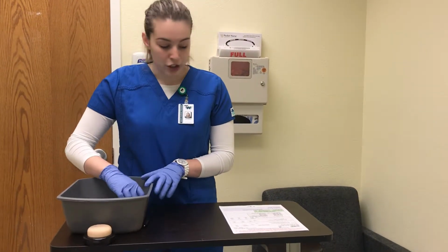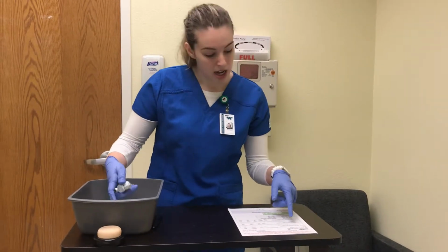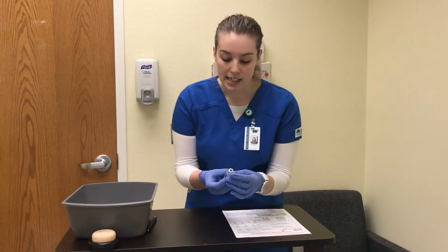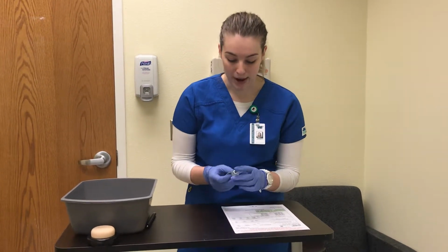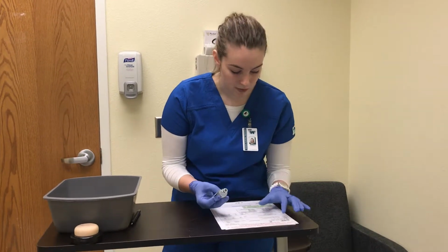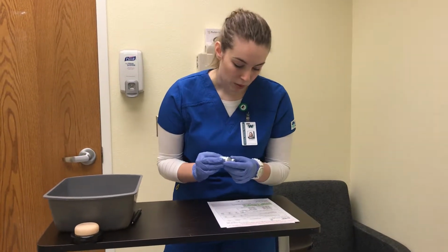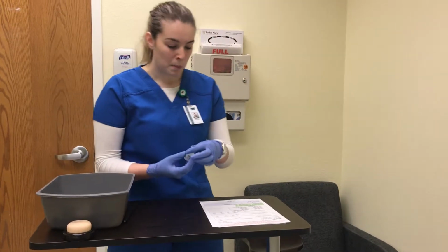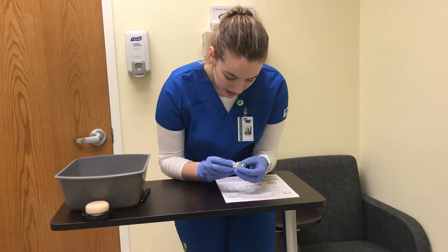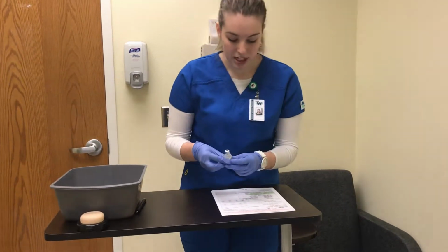So I'm going to start with my demo dose NPH insulin U100, 15 units sub-Q daily with supper. So first I'm going to make sure that I have the correct patient, as these are multiple use vials and they're only used for one patient. So I have Shirley Coast, 54. Date of birth, 5/14 of 64. Dr. Leo, room 211-1. Perfect, so I know I have the right vial. I have my NPH insulin. This is a U100, and I need 15 units for that one.